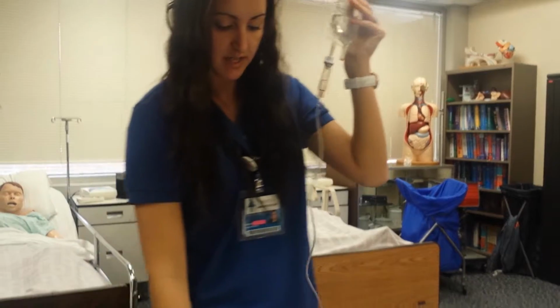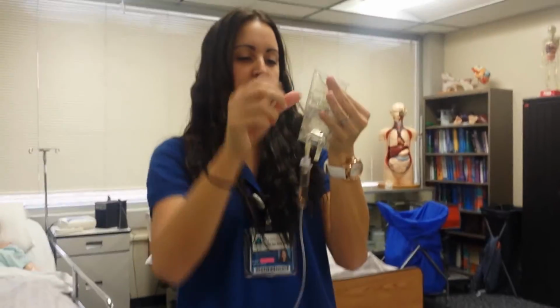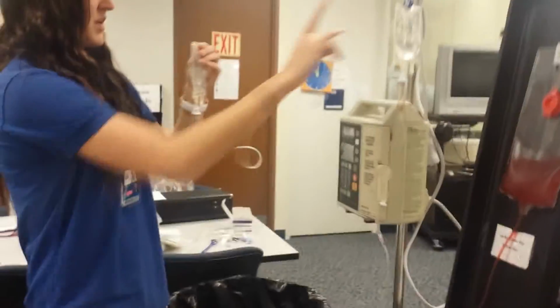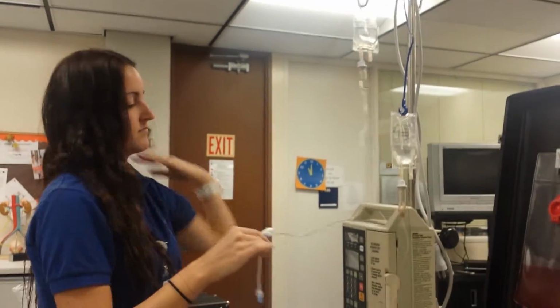Now that it's prepared, I'm going to label my medication: the name of the medication, the concentration, my initials, the patient's initials, and the time I started it, and the site, which is going to be his right AC. So I'm ready to go into the patient's room with my MAR. The primary, I'm going to lower it down so that the secondary, or piggyback, is above it.